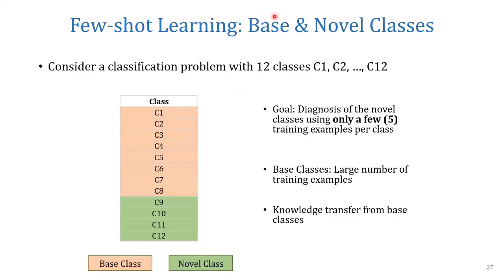So the problem is when we try to use a feature extractor, especially a deep neural network based feature extractor, we may not be able to train such a deep feature extractor using only a handful of image examples. This is important because we have only a handful of image examples corresponding to each disease or condition of our consideration.